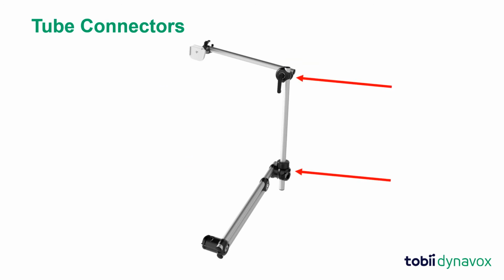Tube connectors connect the tubes. They connect a vertical tube to a horizontal tube, as well as allow the device mount to be configured differently to offer greater flexibility and positioning. Using these components, vertical and horizontal tubes, and tube connectors, one can design a mount configuration to meet the exact needs of the AAC device user.